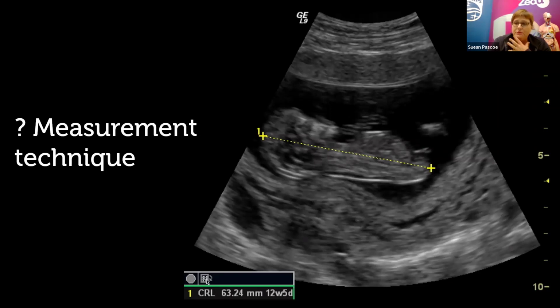After I've done that for each picture, we get on to the measurement technique, which depends on the examination that you're performing. You're just looking to make sure that it's accurate, that the measurements are taken in the correct planes, because the reference values are all very much defined by what the right plane is. For example, the common bile duct we're measuring just after the hepatic artery. Well, it's good to be able to see the hepatic artery to have that reference point.